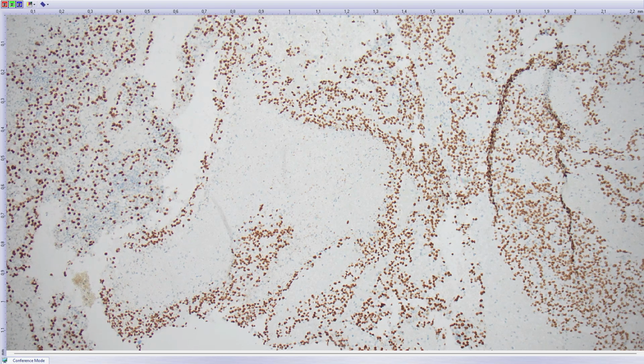According to literature, the difference is in PAX8 positivity or negativity. If the tumor is PAX8 positive, it means that it is TFE3 translocated renal cell carcinoma. If it is negative, it is a PEComa. So this is how these tumors are classified right now. So, PEComa of the pelvic area in a young patient.